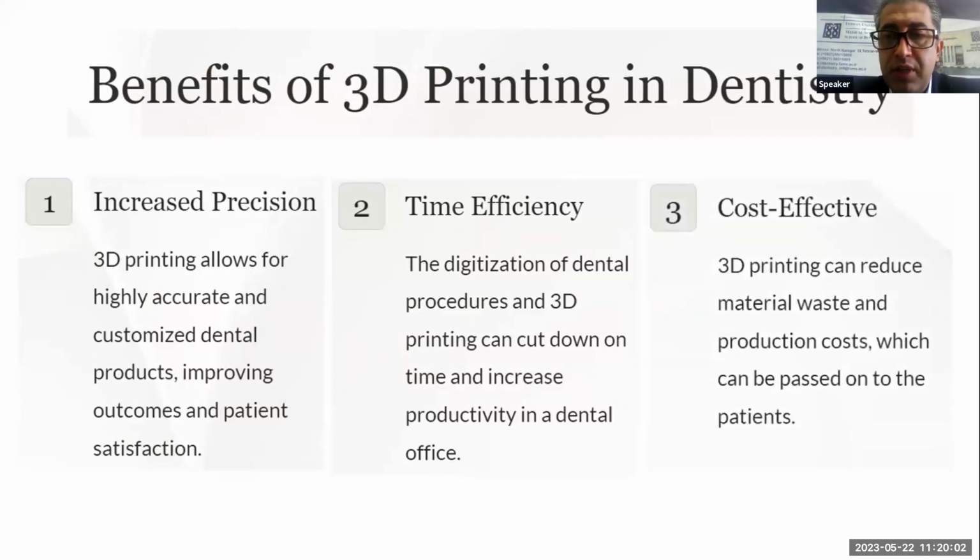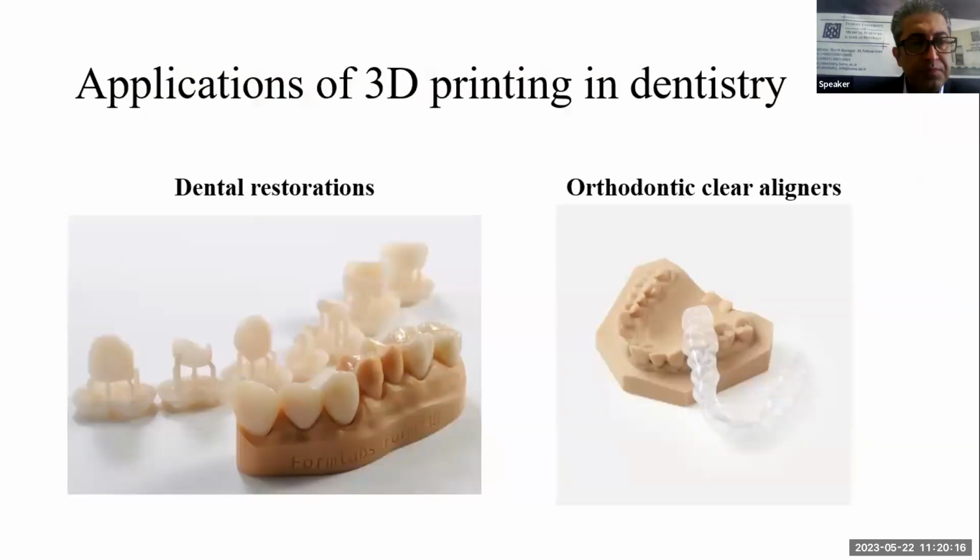And also it's very cost effective, because in comparison with, for example, a milling machine to fabricate some object, it doesn't have any waste material. So it can reduce the cost, and this reduction in cost can be passed to the patient. There are different applications of 3D printers in dentistry. The most common use is in fabricating dental restorations.